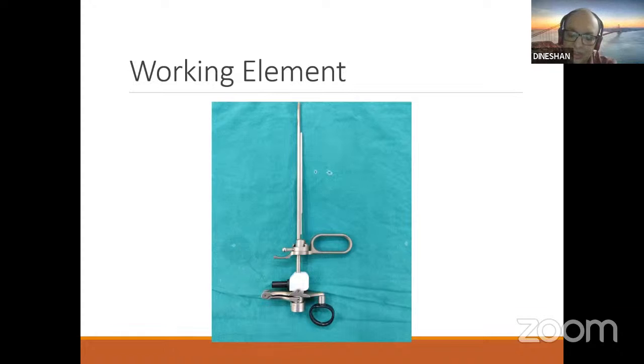The diathermy pillars, you can see the black pillar there. This is the type of single stem working element where you can see this pillar here where your high frequency cord is attached. And for a single stem loop, it is coming to somewhere here. It is getting attached to this area.